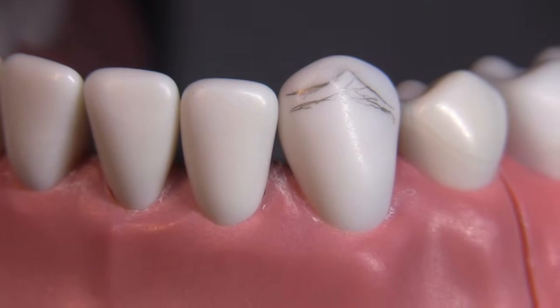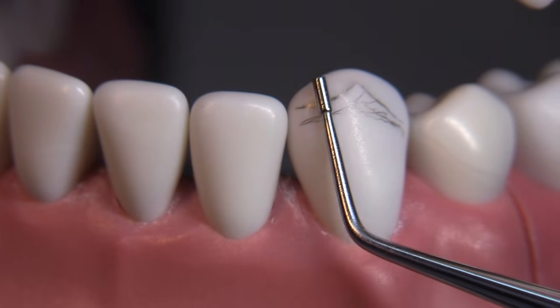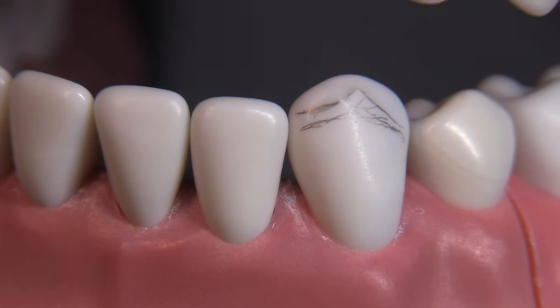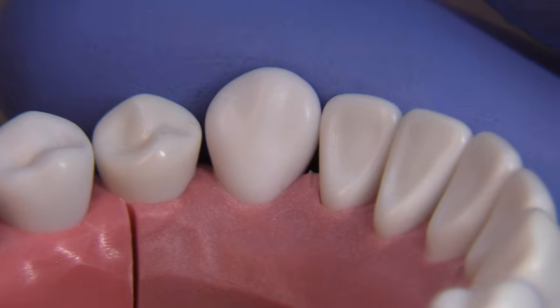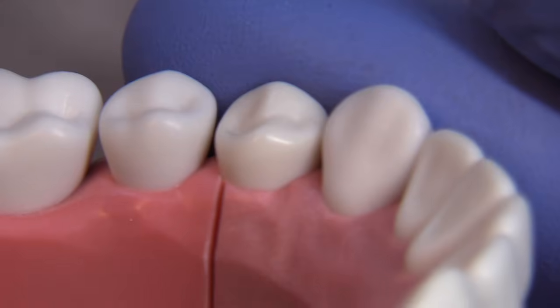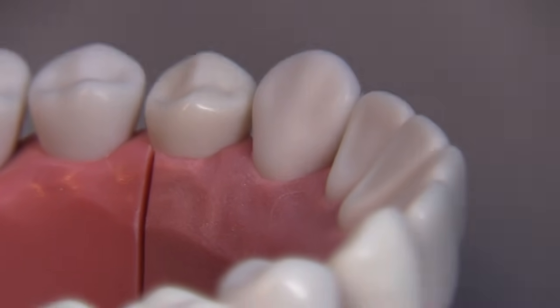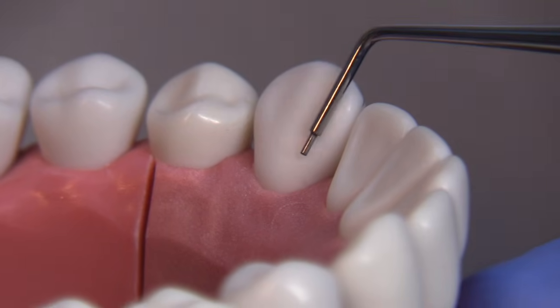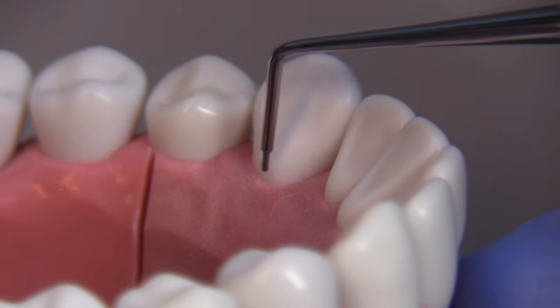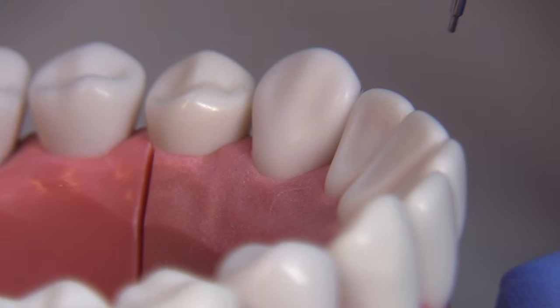I've marked approximately where the opposing teeth overlap. Remember, we're going to have to reduce two millimeters off the incisal edge to provide adequate space for ceramics to create a more natural look. The RGS2 can be used to measure two millimeters. On the lingual, on the typodont, it looks a little like a maxillary canine — it has a ridge and two fossae. We're going to replicate the ridge with one slope going mesially and one going distally, maintaining that ridge down the middle.